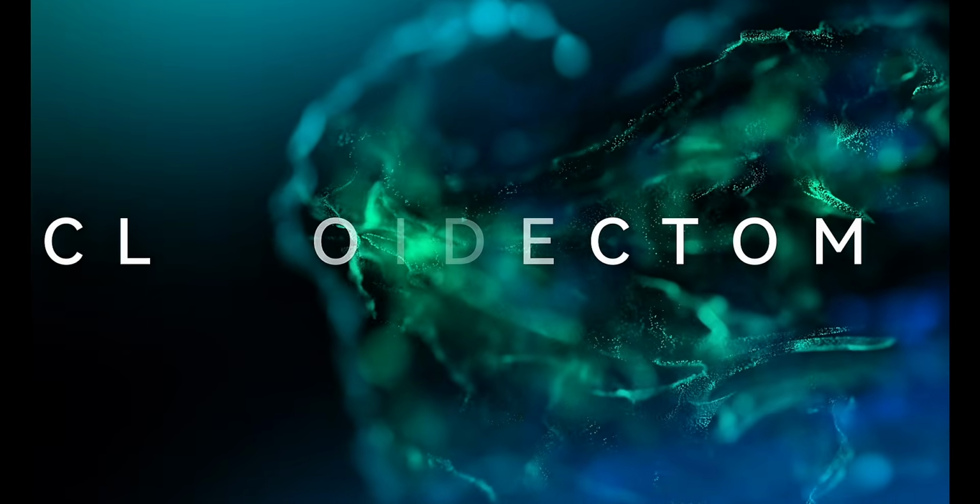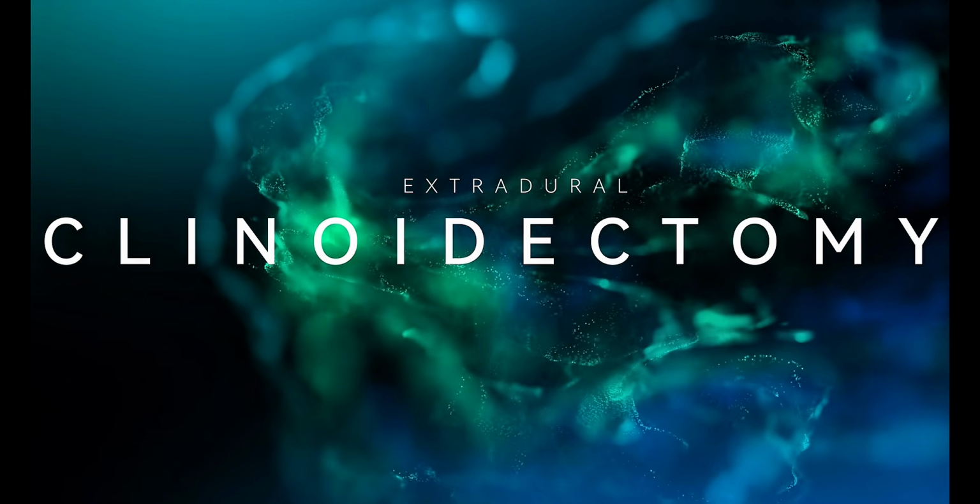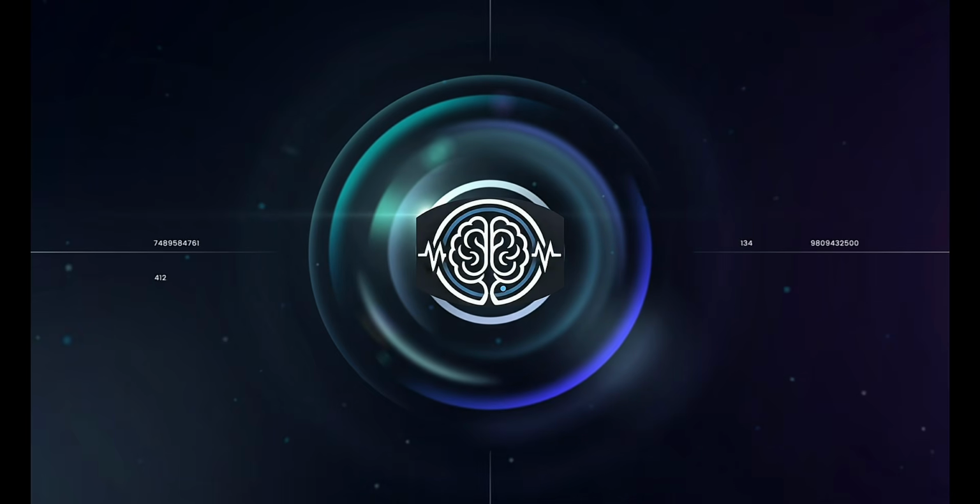Extradural Clinoidectomy. In this episode of Neurosurgical Dissection in Motion, we demonstrate the technique of extradural anterior clinoidectomy performed through a supraorbital approach.